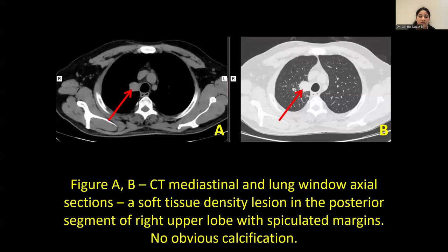These are the CT lung window images, axial sections, in which a soft tissue density lesion can be seen in the posterior segment of the right upper lobe with speculated margins. Also, we can see there are no obvious calcifications within.